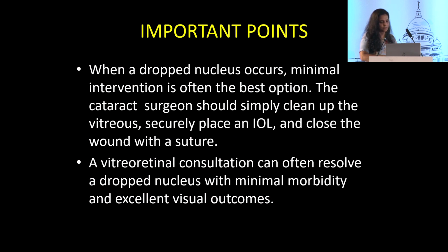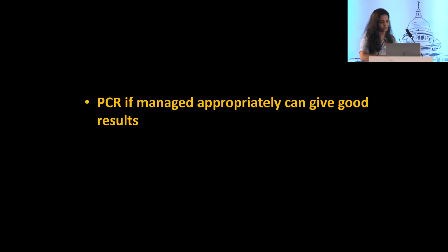Minimum intervention is the best option when you have a dropped nucleus, and a vitreoretinal consultation can often resolve a dropped nucleus with minimum morbidity and excellent visual outcomes. So PCR, if managed appropriately, can give very good results.